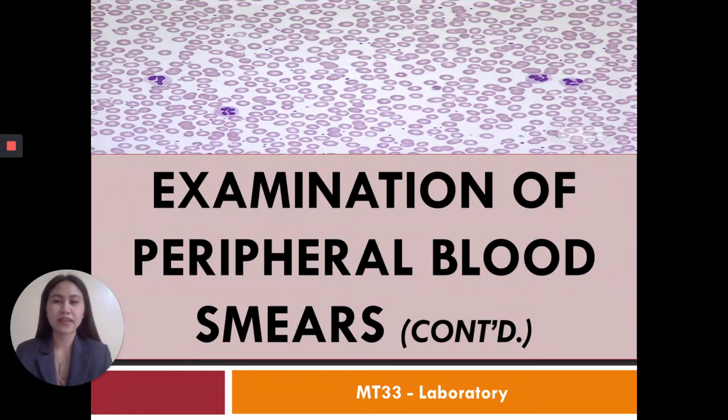Good day, everyone. This video is for Laboratory 8 for differential count procedure. Before I start, differential count is actually part of the complete blood count. To perform differential count, we'll have a short video to show you the procedure.